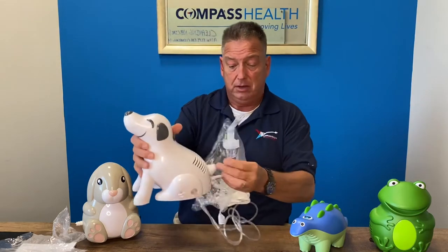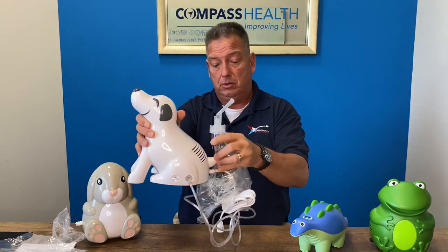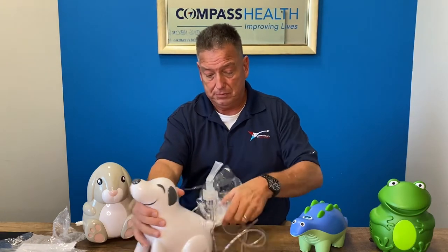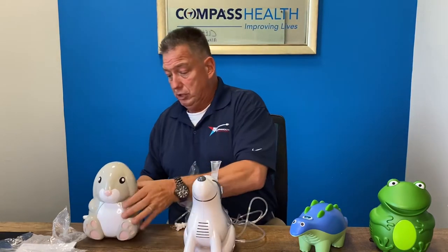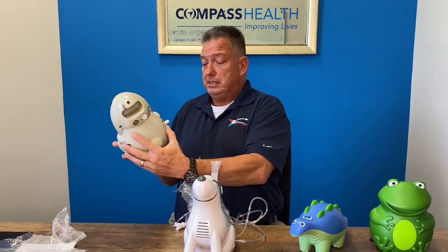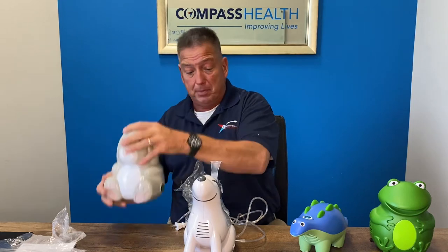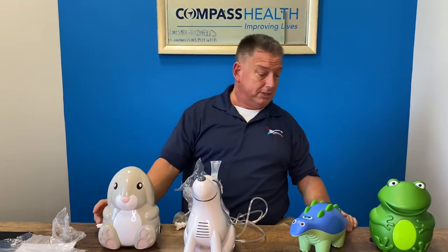On the tail is the little holder for the neb circuit so it can stand up like so. Each unit has all these same features, just located in different spots. There's your tubing holder on the bunny, and the dino has it on his tail.